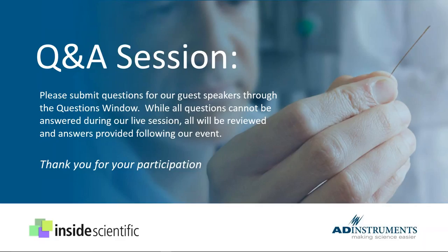You certainly can, and some additional information to this is, you can certainly record from all the segments and gather that information, even if you make a decision ahead of time about how many segments you're going to be using. But what you should also consider is that each of those will affect the way your calibration works in a multi-segment catheter. If you're going to plan in advance to have a certain number being used during one portion of the study, and perhaps you have to expand that, keep in mind that each of those has a volume associated with it. So you want to make sure you retain that information so you can apply it later.